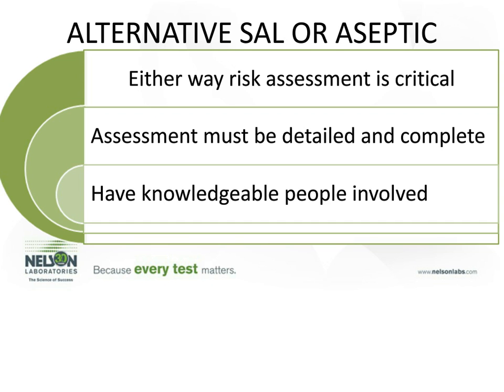But this type of risk assessment does not involve only the manufacturing aspect, the sterilization aspect, the impact of product from sterilization. A deep knowledge of sterilization processes and how those can be optimized is critical. And that type of knowledge is often not present internally. So please involve someone who does have that deep knowledge on the sterilization side as well as part of that risk assessment.